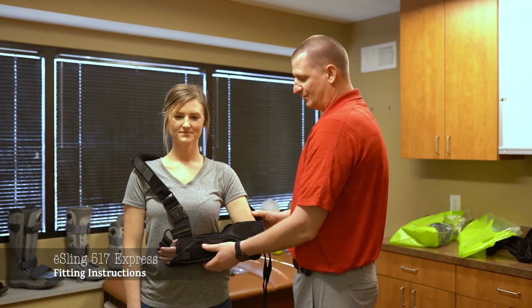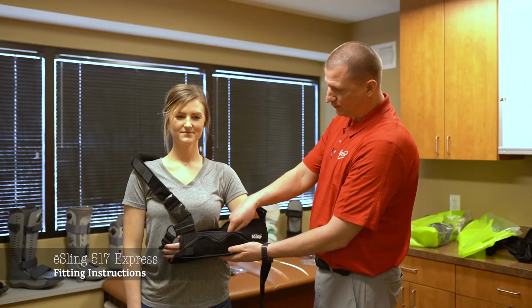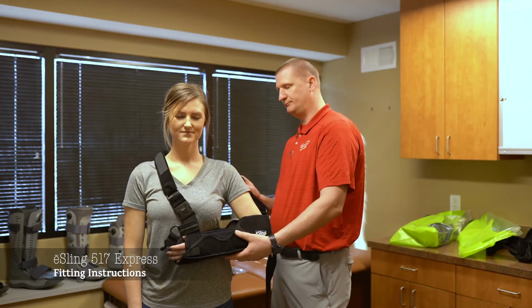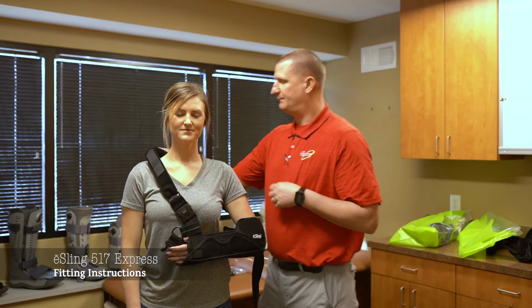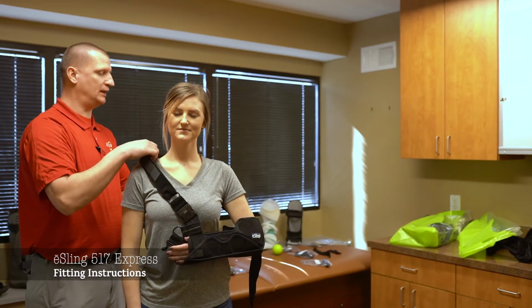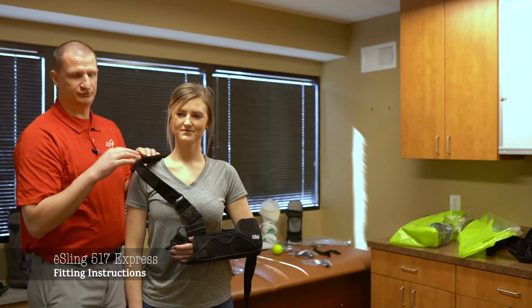Okay? With keeping the patient's elbow at 90 degrees and with the elbow back into the cradle, okay, we're going to position this crossbody strap. Okay? It is very important, through the strap there is a sewn-in pad here, okay, which needs to go over top the patient's shoulder. Okay? This obviously is for comfort.